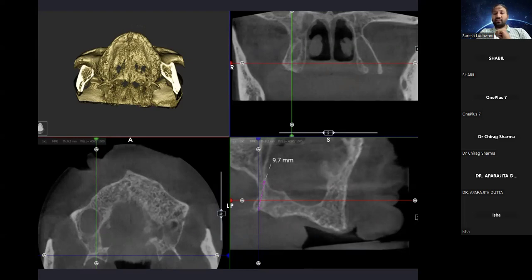When you measure the angle with a protractor or some instrument, you can use the same thing sterilized in the clinical scenario and mark it on the buccal side. This gives you an orientation in which direction you are going.